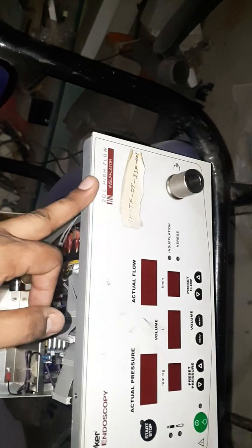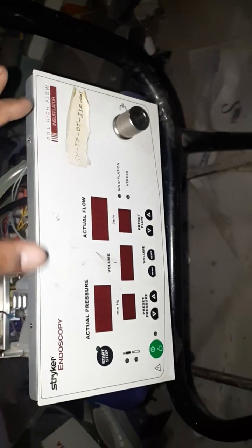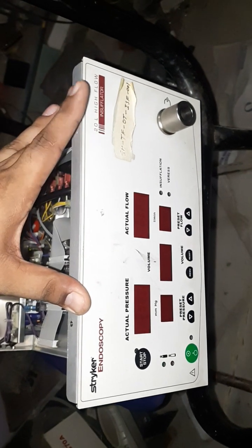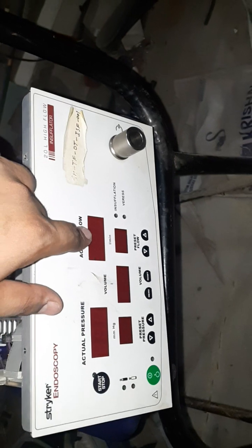Insuflator. This is a 20-liter high flow insuflator. This is the old model of Stryker endoscopy, and this is only the carbon dioxide based insuflator. This is the output of the insuflator. There are the control functions of the insuflator. There are some 7 segment displays available on the front screen of this insuflator.